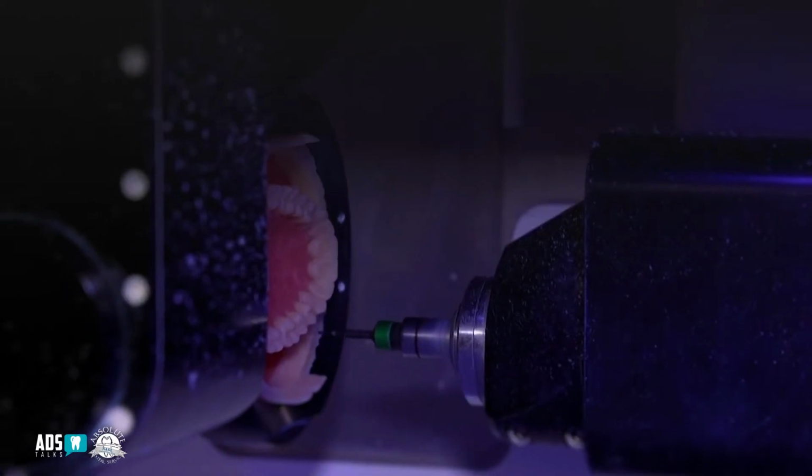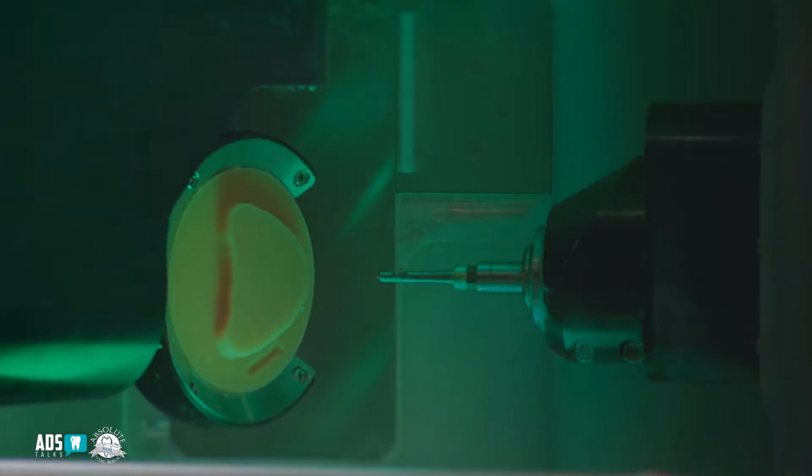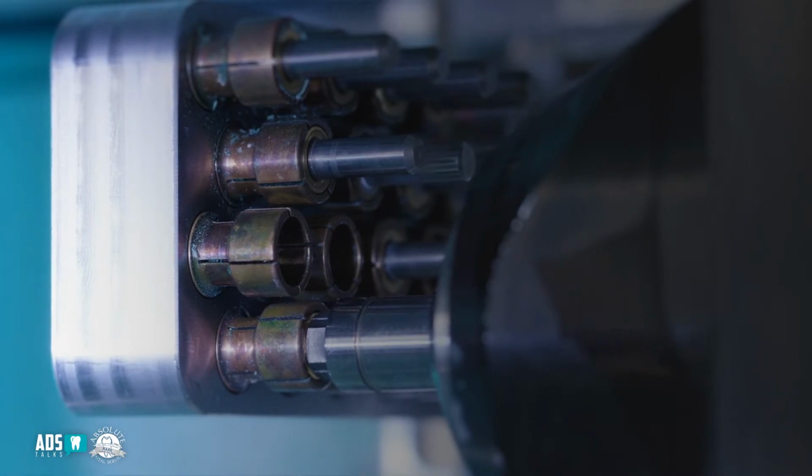So one of the questions I get regularly from other technicians is how much hand processing is required after the Ivotion puck comes out of the PM7? That's another great question and very relevant. We have 3 milling options on the Ivoclar PM7, high or standard detail and a fast milling cycle. Each of these cycles will produce a different level of detail and also a different milling cycle speed, obviously.